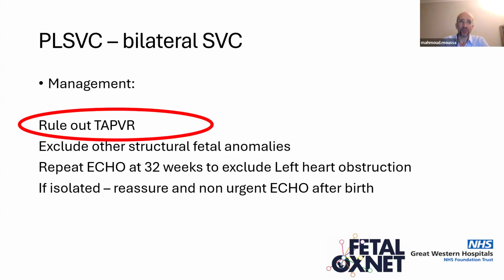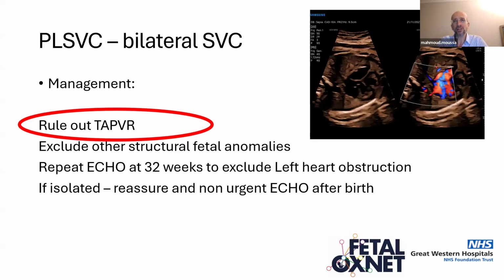Remember, you have to rule out the anomalous pulmonary venous return, and there are 2 golden rules for checking the pulmonary venous return, which is easy actually and simple to do. So you can either check the pulmonary veins, at least one on each side. So you want to see one pulmonary vein entering the left atrium, one on each side at least. We all know that there are 4 pulmonary veins.